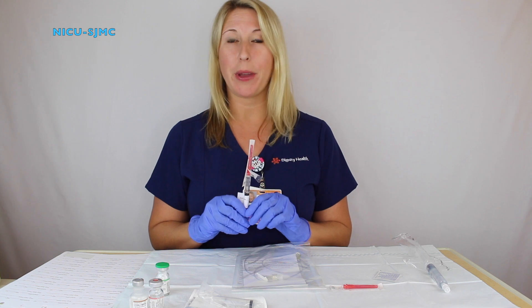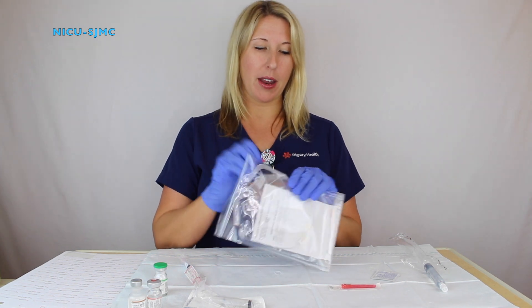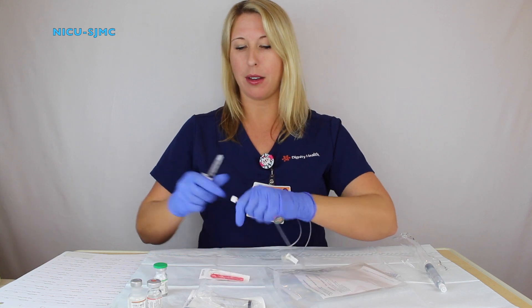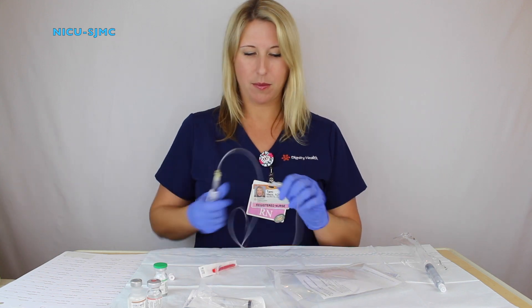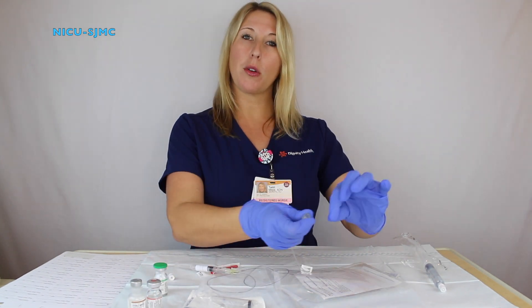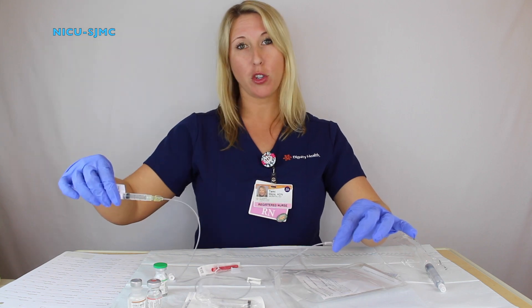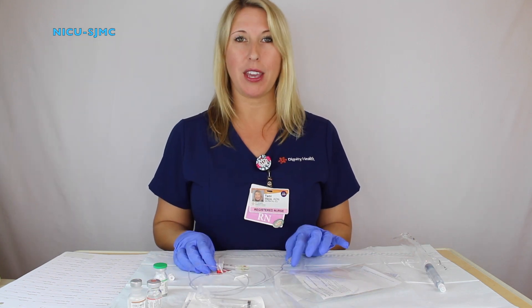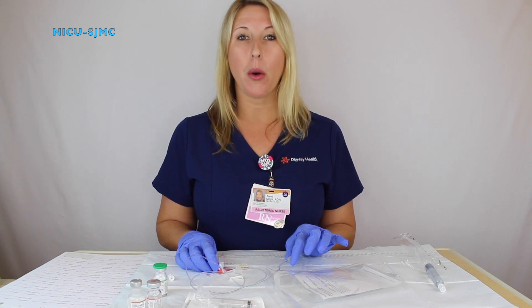When administering ampicillin to a patient who simply has a heparin lock, you will need a micro-bore extension tubing. Go ahead and prime the micro-bore extension tubing with your ampicillin, hook directly on, and prime it through until it comes to the end. Take off your curos on your hub and hook directly on. Place the syringe in the syringe pump, follow the prompts, and administer the ampicillin. At the end, end with the flush. If you are hours away from giving another medication, go ahead and heparin lock your line again. Otherwise, wait until after the second medication is given and flushed before you heparinize your line.